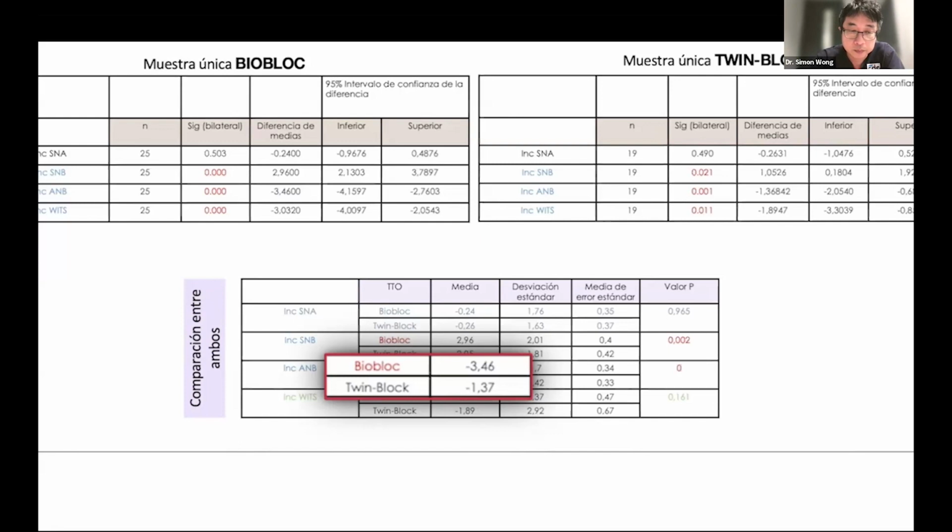Now, we know, and we have been given definitive research to show, functional appliances can only move teeth within their dental alveolar bone. There is no capacity consistently for functional appliances to have a skeletal effect. The exception to that rule to date is the Frankel appliance, that's been shown to work quite well in marginally improving AP discrepancies on a skeletal basis.